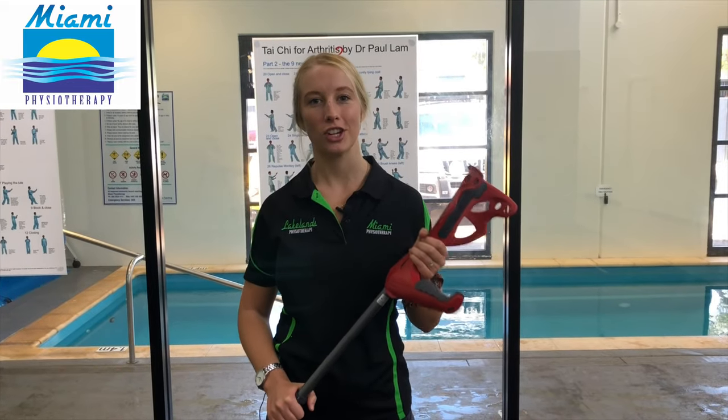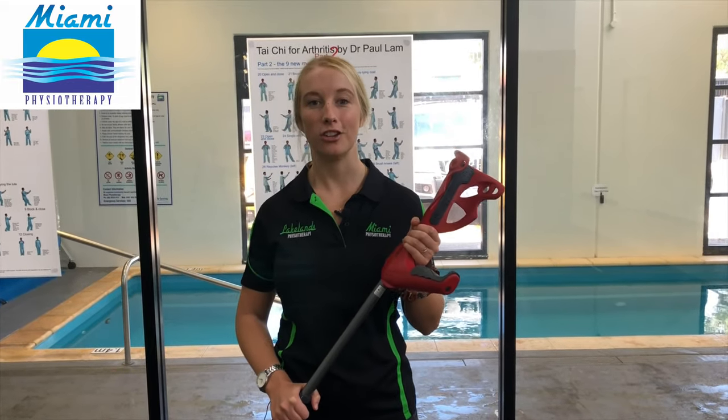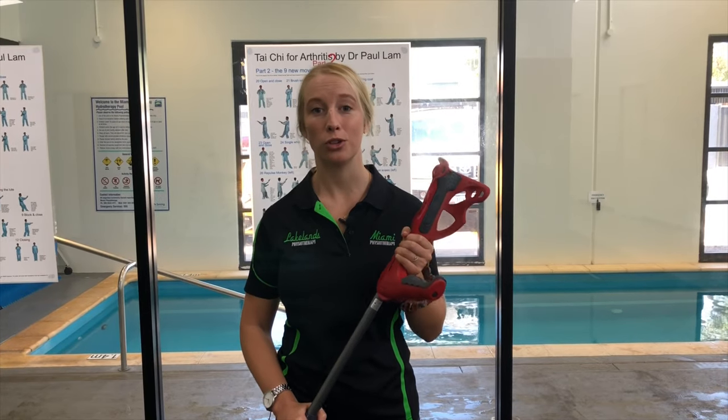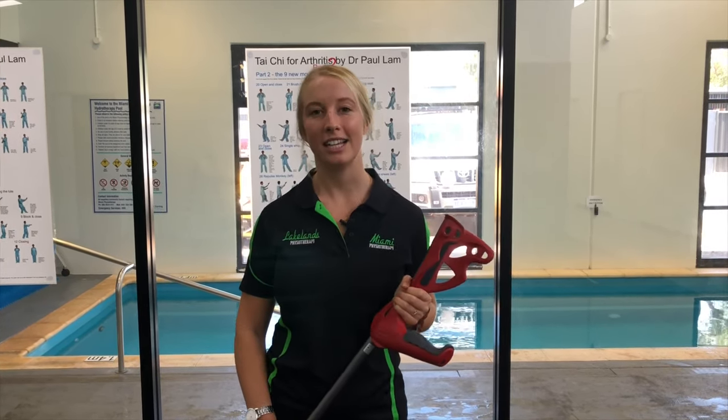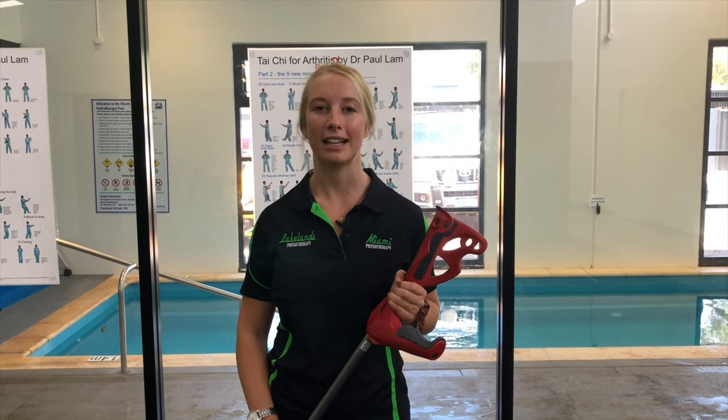Do you walk with a stick or a crutch? Stay tuned and watch this video to let me show you how to make sure you're using it correctly for your injury. Hey guys, it's Anya here from Miami Physiotherapy and Lakelands Physiotherapy, and I wanted to take a moment to teach you how to use a crutch.